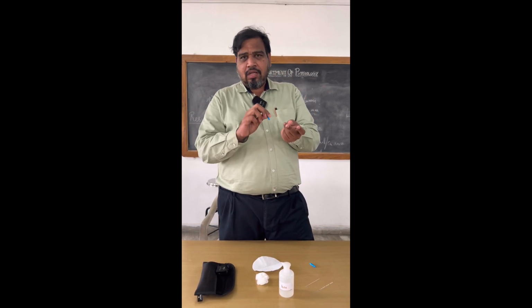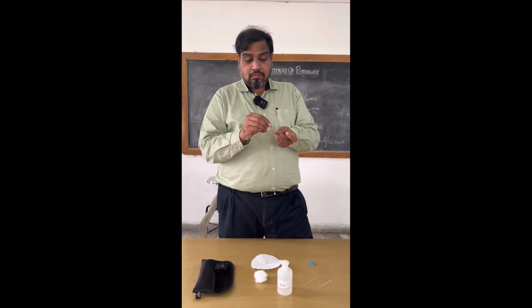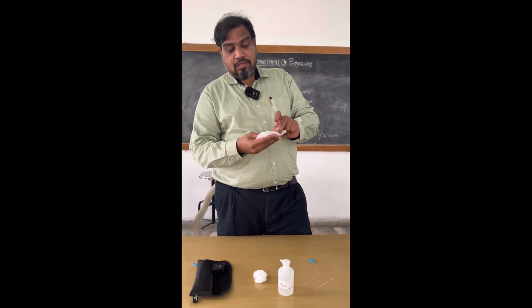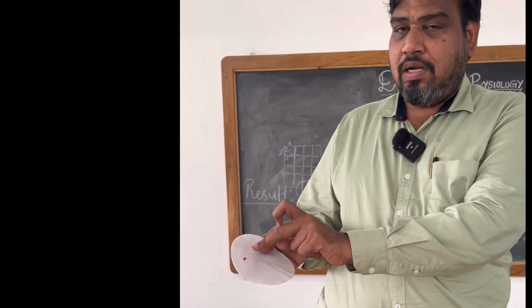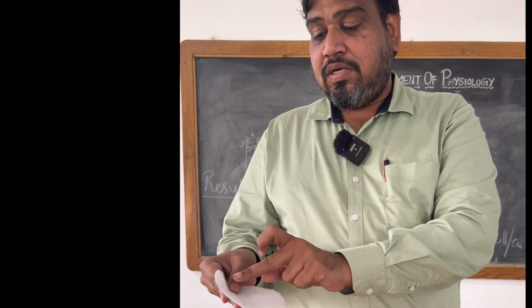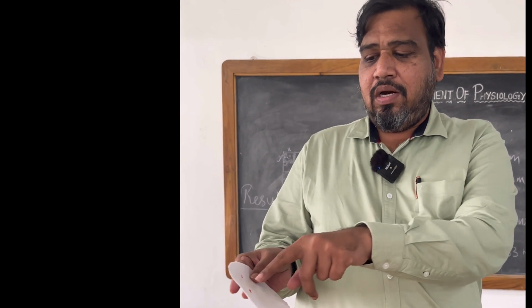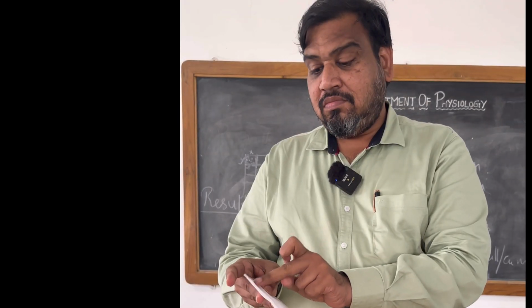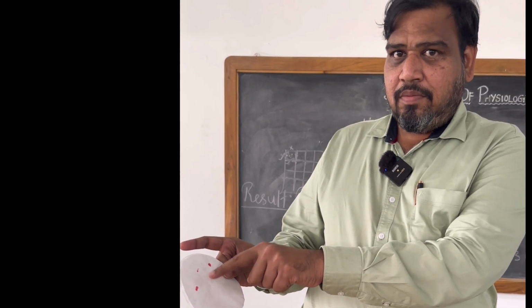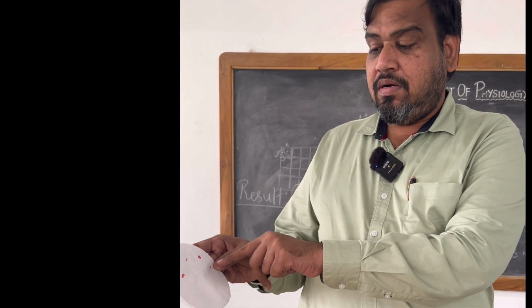So now I'm pricking, I already sterilized. I just pricked, you can see there. Now I mark it. Immediately if I keep it, you can see the red color, that is 0 seconds. Then I note the time; after 15 seconds, I'm still having the blood, you can see. Then again I wait for 15 seconds, so I will mark here 0, 15, 30. Then again I'm able to get the blood drop. So at 0 seconds I was able to get the blood drop in red color, 15 seconds blood drop, 30 seconds blood drop, 45 seconds blood drop.